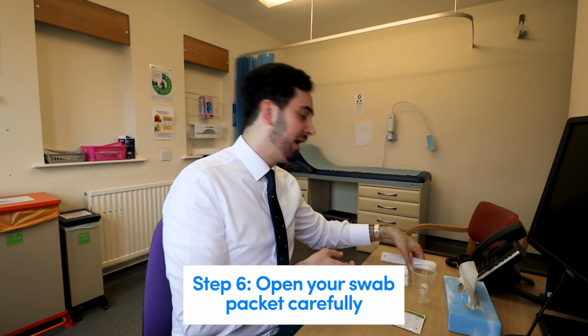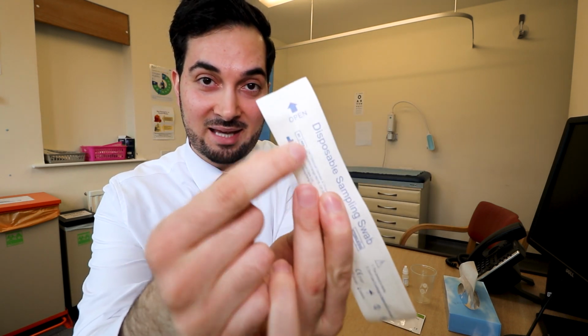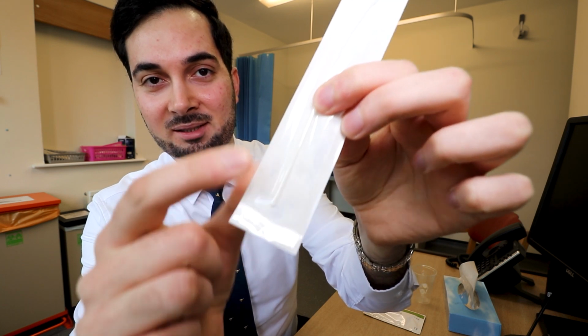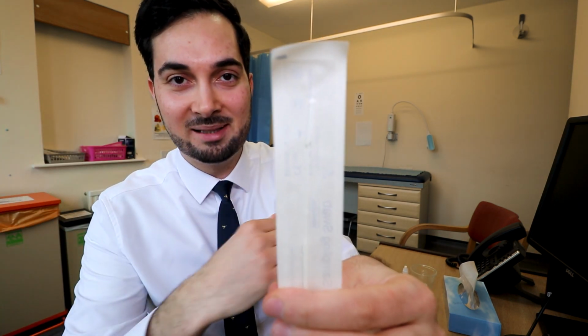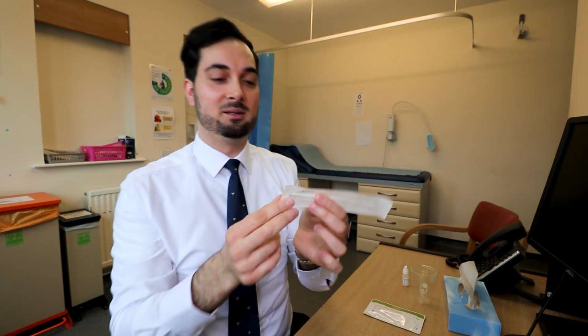Now we're going to prepare our disposable sampling swab. Please notice how it says open on this end of the sampling swab. The reason for that is that this end is where the handle is, the plastic handle. This end is where the fabric side is that we're going to stick in our nose or in our throat, and we're going to go through that in a second, okay? If it doesn't say open, just open it on the side that the handle is, okay?